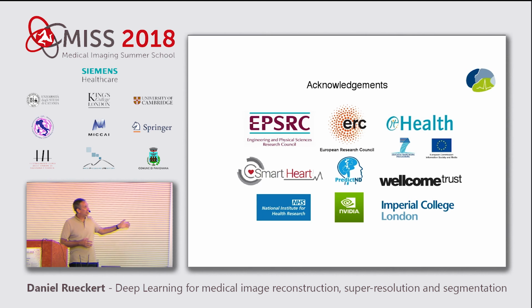I have not yet seen, for example, any application of MR fingerprinting to dynamic data, so most of the work is done on the brain. And in almost all the cases, you can see that the image quality is not quite there as with a conventional acquisition. But of course, a conventional acquisition takes much, much longer to do.